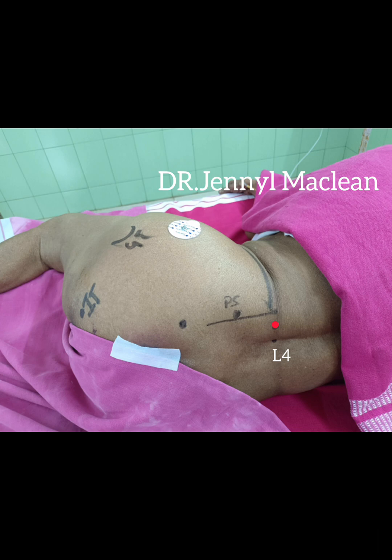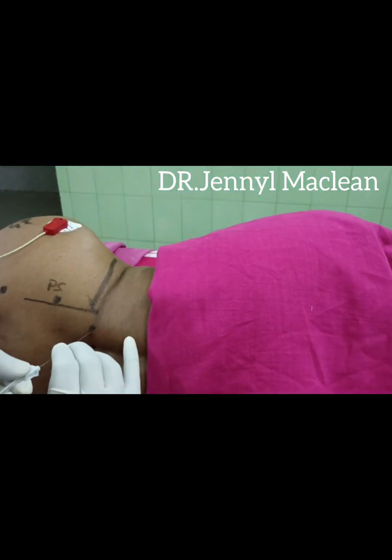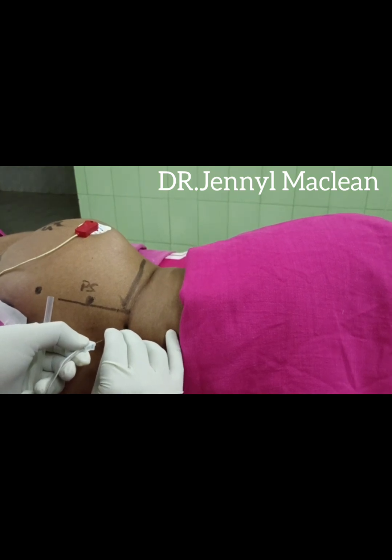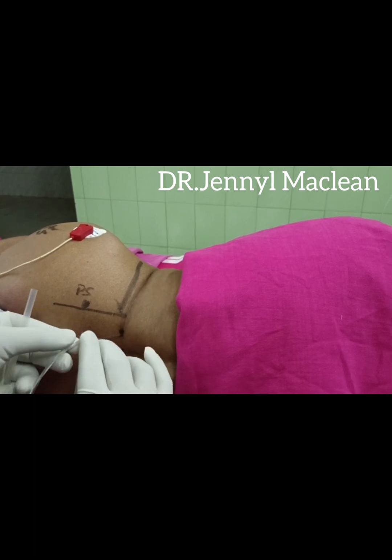The needle is advanced at right angles to the skin until the transverse process of L4 is encountered. If encountered, the needle is redirected either cranially or caudally, not more than 2 cm. The needle is inserted at the puncture site perpendicular to the skin. Once you hit the transverse process of L4, the lumbar plexus is less than 2 cm away.